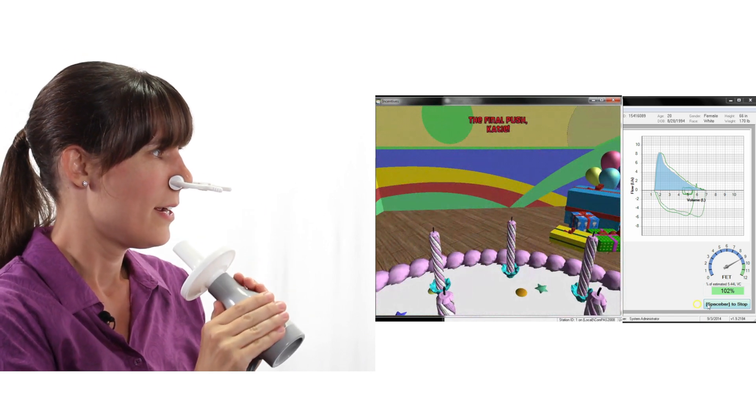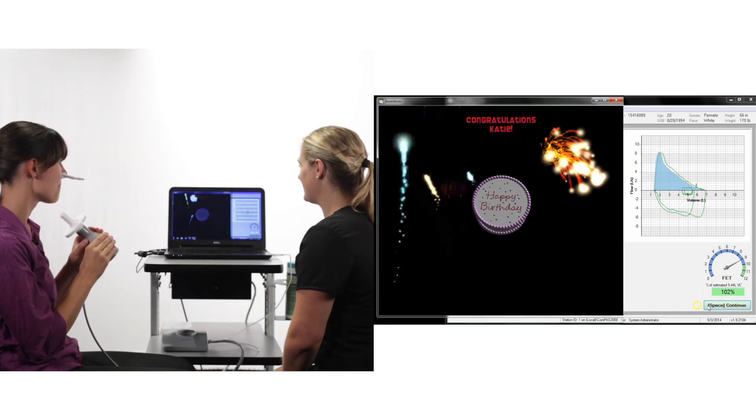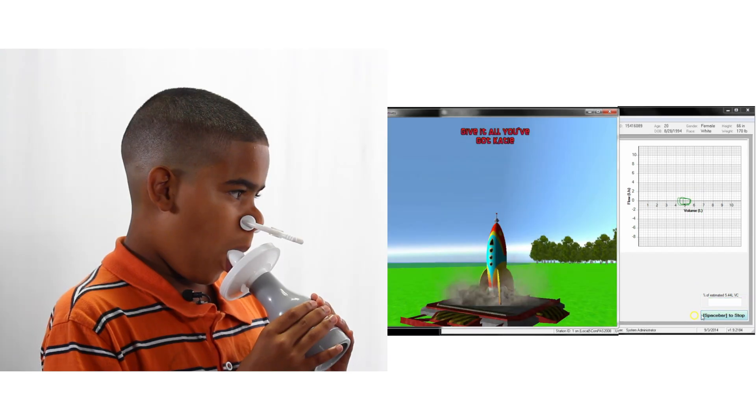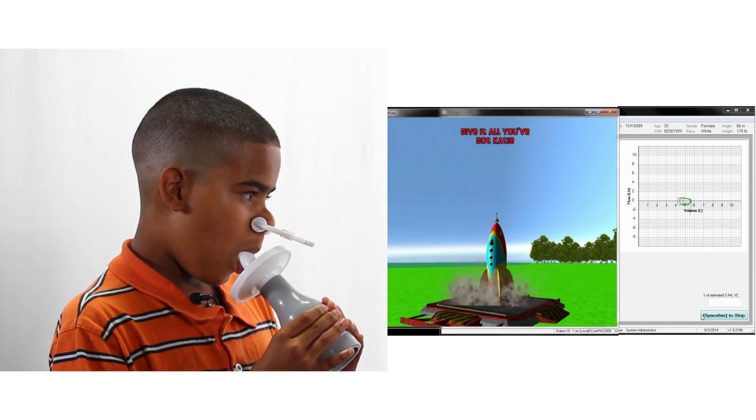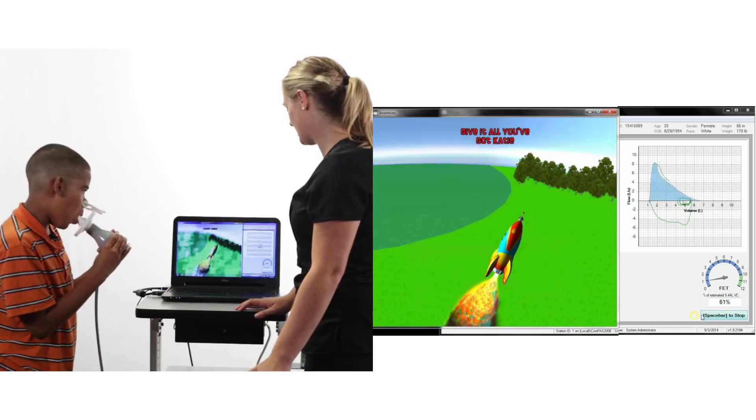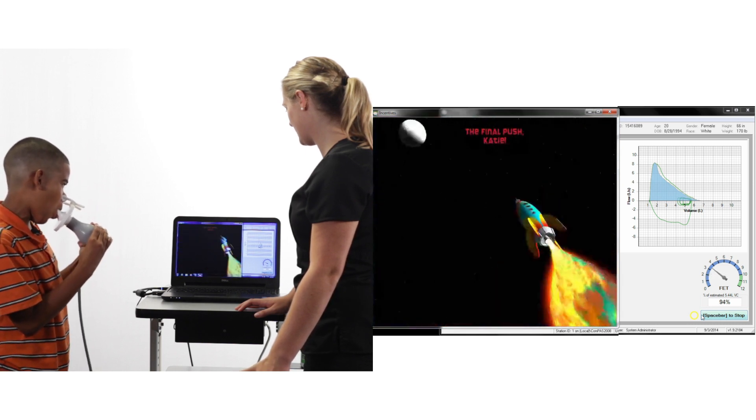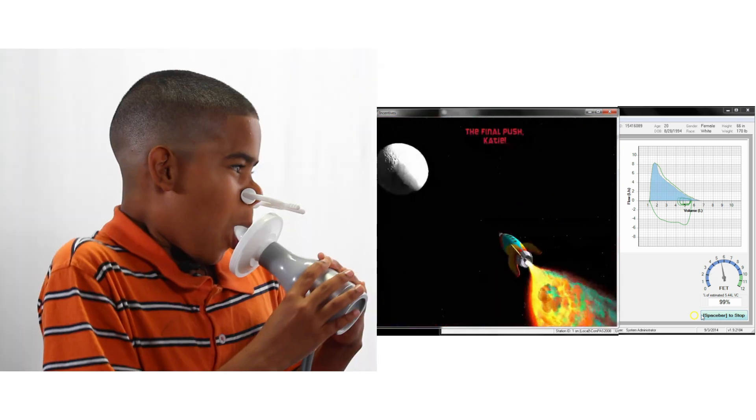We recommend that you choose a position that allows you to see the flow volume effort as the animation is running. To resize the animation window, click on any corner and drag the window to the desired size.